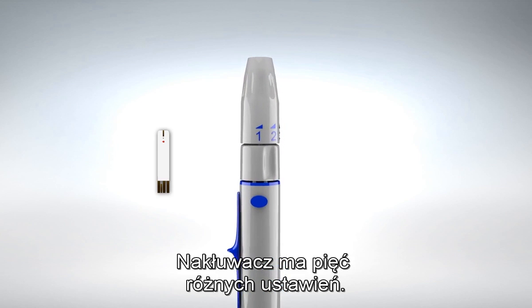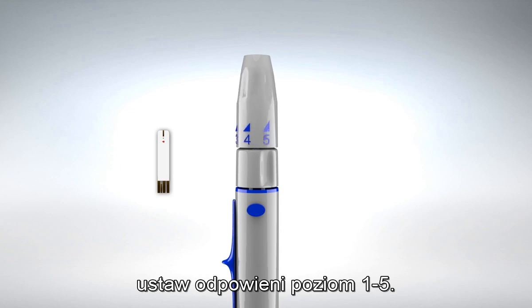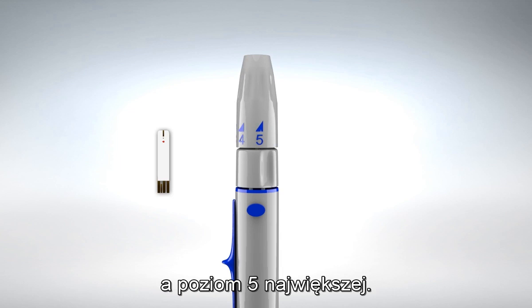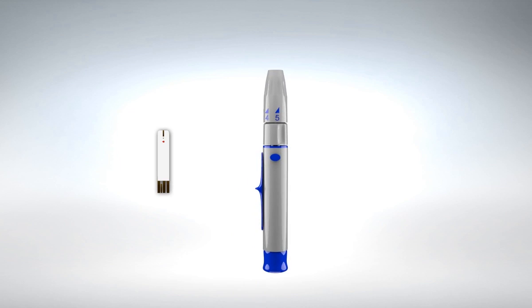The lancing device offers 5 different settings. Turn the upper top of the lancing device to the desired level, 1 through 5. Level 1 is the shallowest depth, and level 5 is the deepest. Now you are ready to proceed with the glucose level test.